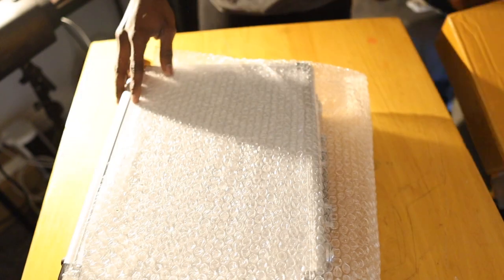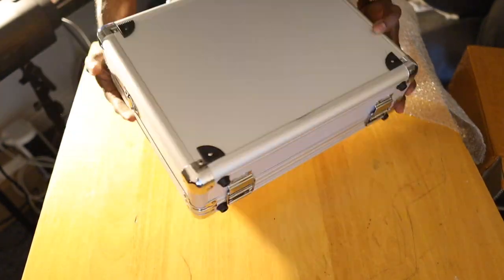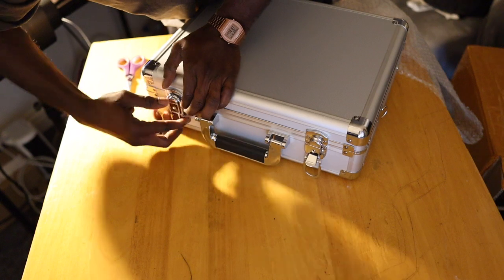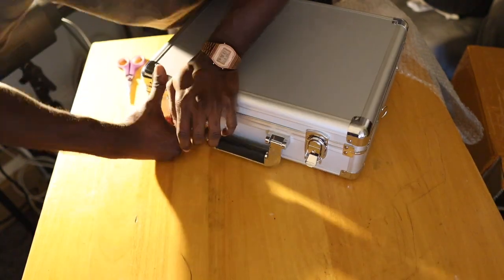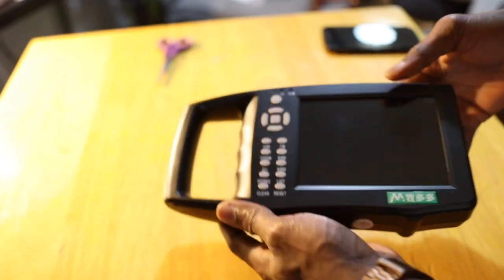Let's get into it and see how it looks and how it works. One of the primary uses is to confirm and monitor pregnancy in various animals — you can use it on pigs, cattle, sheep, as well as domestic animals like pets, dogs, and cats. It could also be used for organ examination, helping to diagnose any health conditions your farm animals may be suffering from.